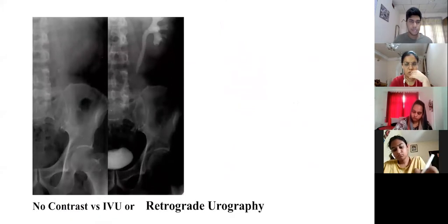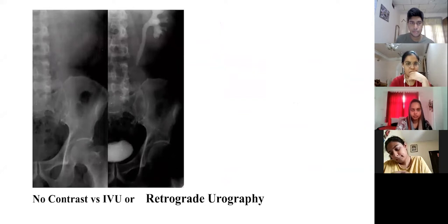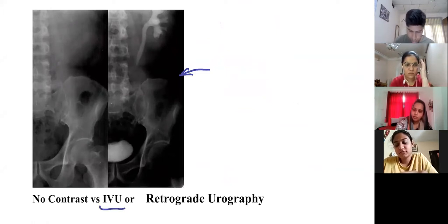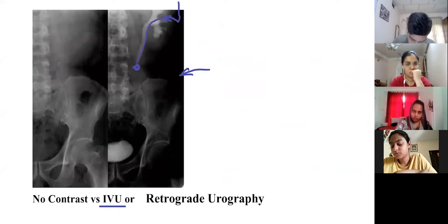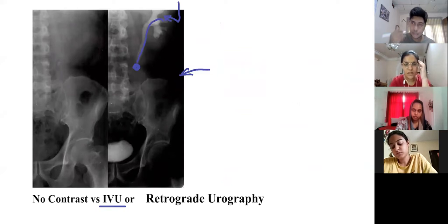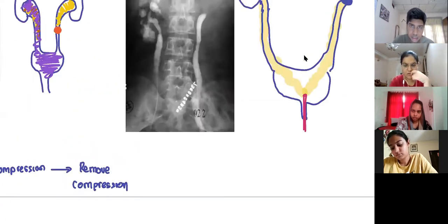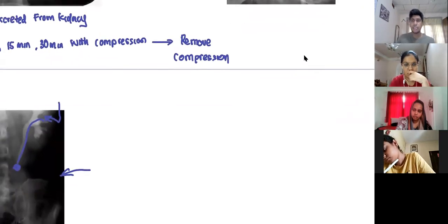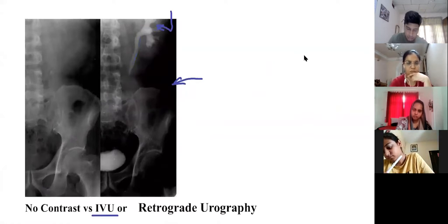Is this IVU or retrograde urography? The dye comes from blood into the kidneys going down and it's obstructing - so this is IVU. In retrograde urography you would see the catheter. I just want you guys to understand the difference between IVU and retrograde urography. I didn't get the retrograde - okay, you send in a catheter and then release the dye.